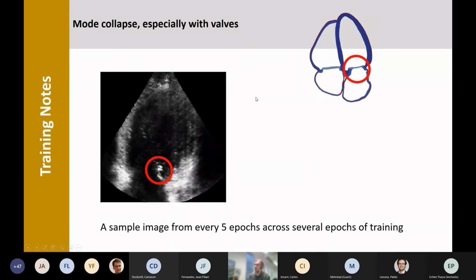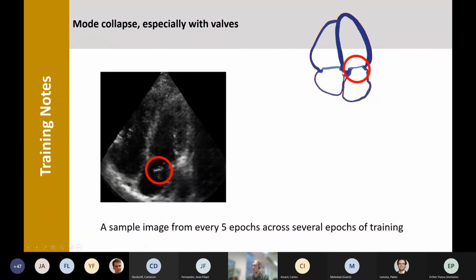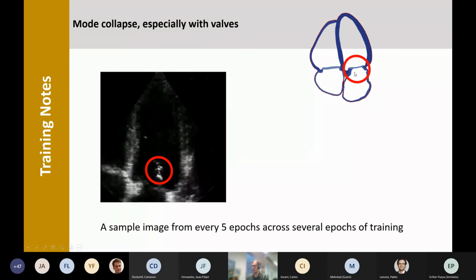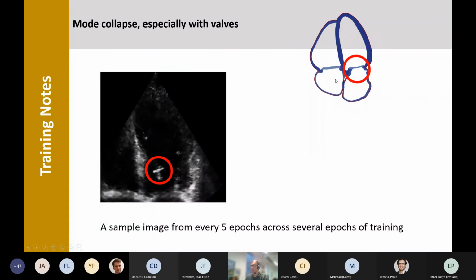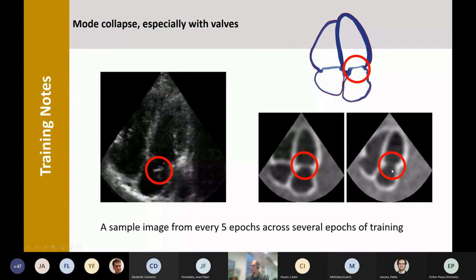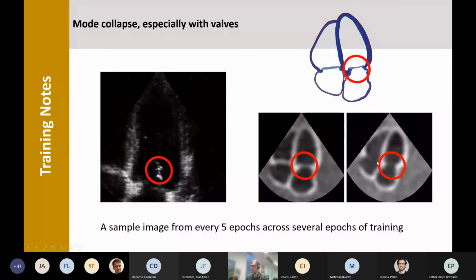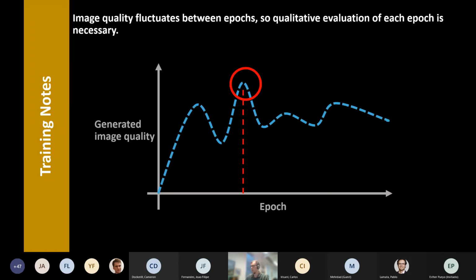That's because the CT images don't have enough resolution to find the valves, so the valves are just modeled as flat slabs, which is of course not comparable to real echocardiography images. So we removed the valves in some of the pseudo images to allow the model to generate realistic looking valves itself, and we saw that helped a little bit.